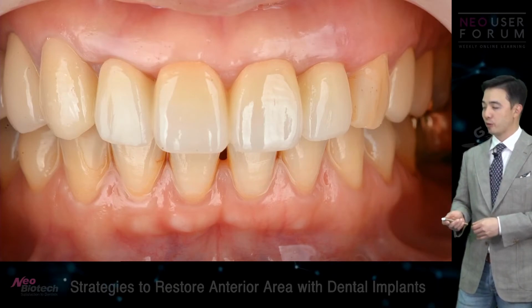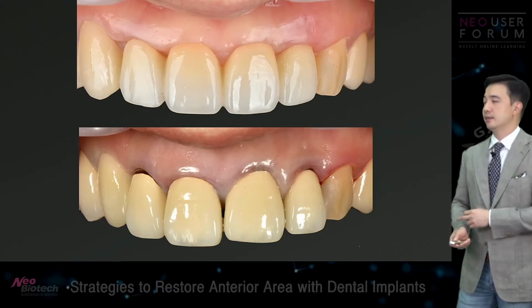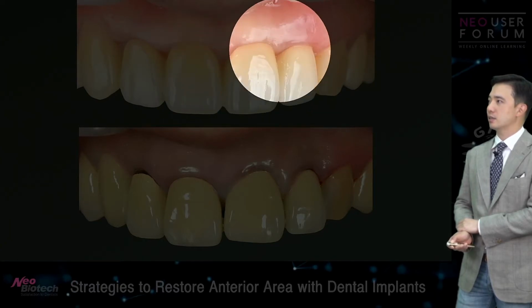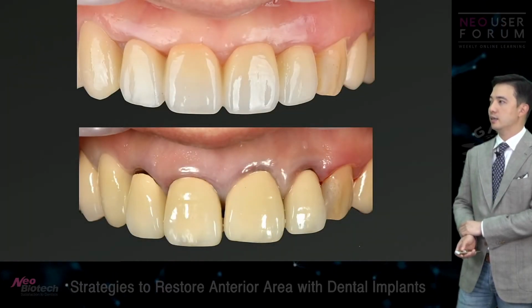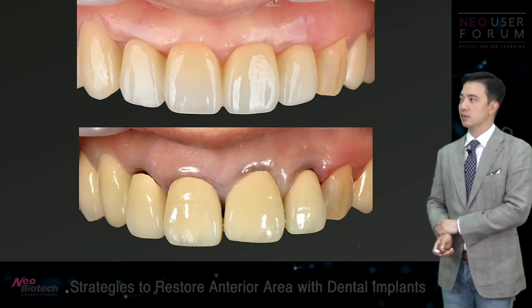And the patient was happy because she never really went through big pain. Yeah, so the papilla, I did lose a little bit compared to what I had, but I think I would say this is good enough.